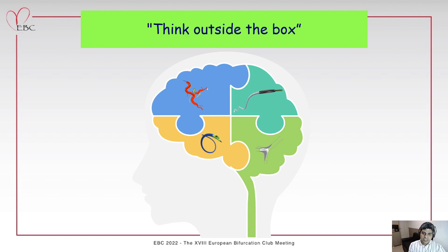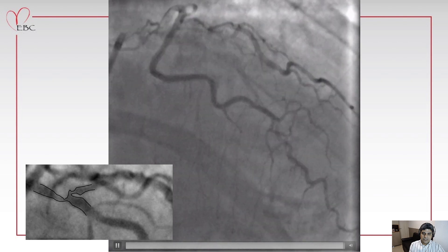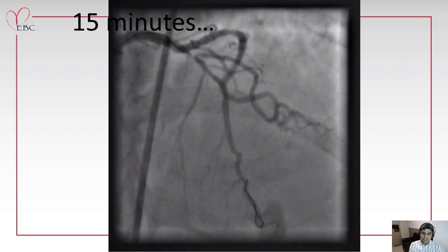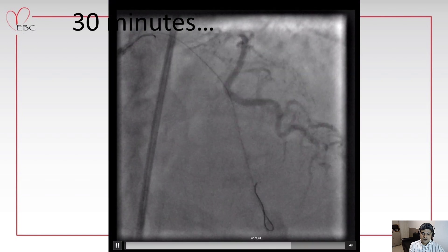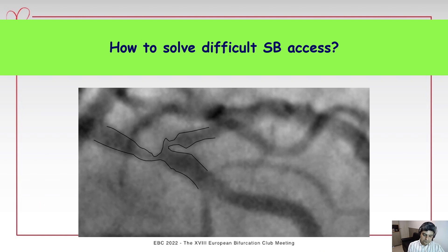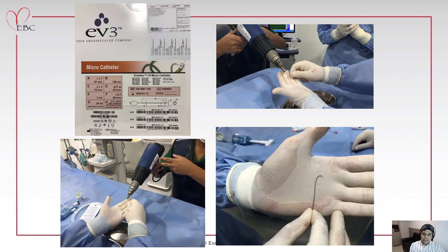When nothing works, we have to think outside the box. This is an example of an LAD diagonal bifurcation with a very acute retroflex angle of the side branch. We tried our best to manage it but could not wire the side branch due to this acute retroflex angulation. After 30 minutes of attempts with many operators, many wires, and many wire reshapings, we decided to move to a different technique. We used a non-conventional microcatheter used in neurology and neurointervention — a shapeable microcatheter. We used a stylet to shape it with a very acute shape, as we didn't have a pre-shaped microcatheter like the Supercross available at that time.